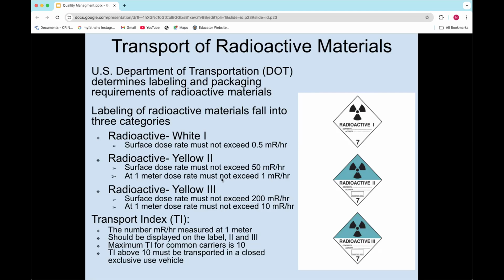And just while we're talking about that, a good tip if your techs haven't shown you that: I've really liked over the years to know if I'm a meter away, because how do you determine if you're a meter? Do you get out a ruler? A good way to do it is that most of your survey meters are going to have the part that has the graphic on it or whatever shows you the reading, and then you're going to have the head, and usually you're going to have a line in between that. That line is close to a meter.